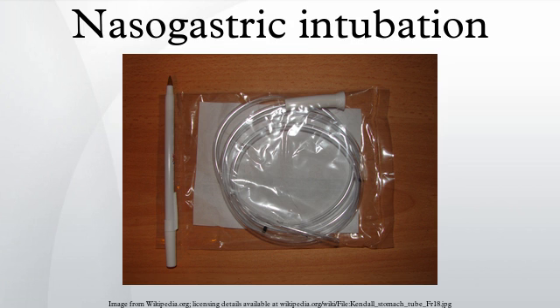If the tube is to be used for continuous drainage, it is usually appended to a collector bag placed below the level of the patient's stomach. Gravity empties the stomach's contents. It can also be appended to a suction system, however this method is often restricted to emergency situations, as the constant suction can easily damage the stomach's lining.